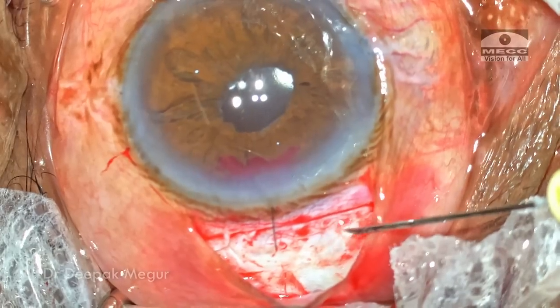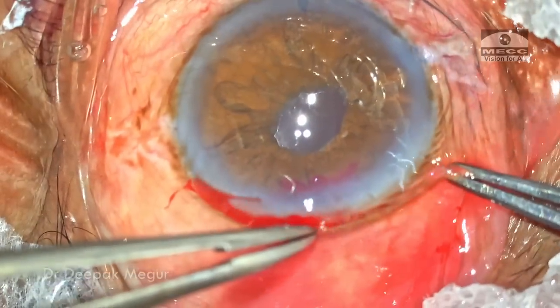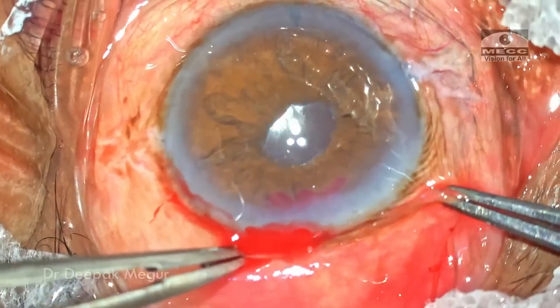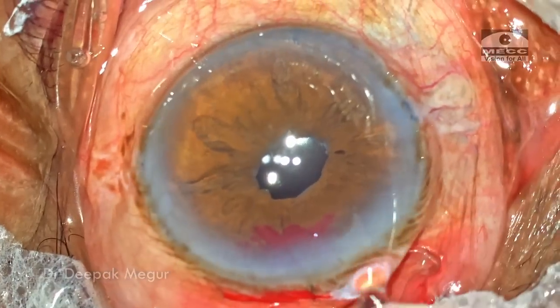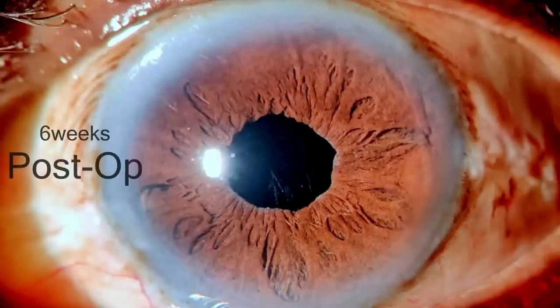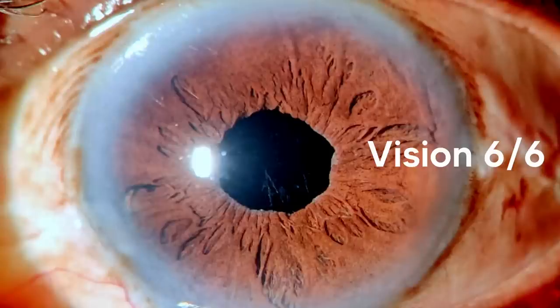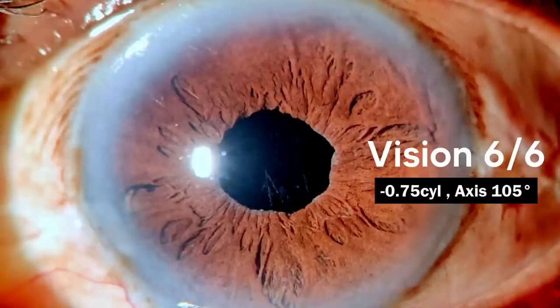I'm going to use glue to close the conjunctival flap — a couple of drops is good enough to attach the conjunctival flap. That's it, the case is done. These are the post-operative pictures, and by six weeks the patient had an excellent visual recovery with a best corrected visual acuity of 6/6. He has a residual cylinder of about minus 0.75 at 105 degrees.